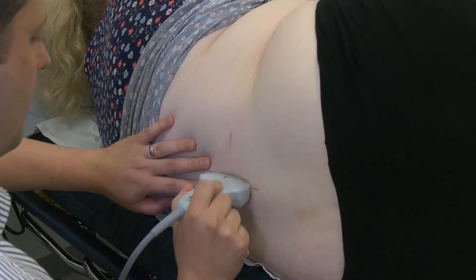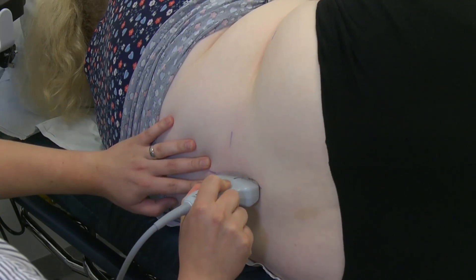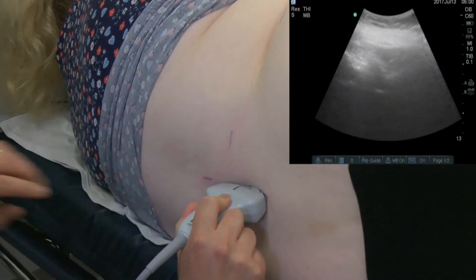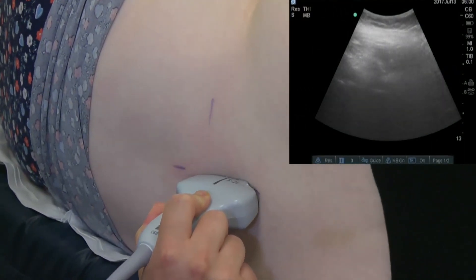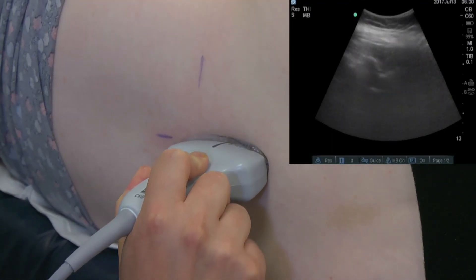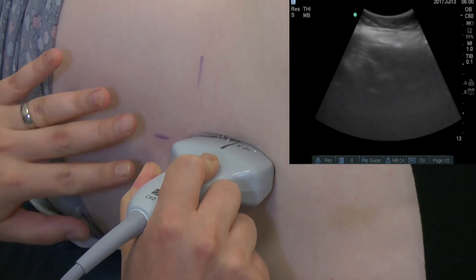Place the probe on the skin in the sagittal plane, parallel to the presumed midline in the lumbar region. Move up and down until the spinous processes are seen — this will give the midline in the sagittal axis. To find the L3/4 interspace, start by moving the probe caudally until a horizontal line appears; this is the sacrum.